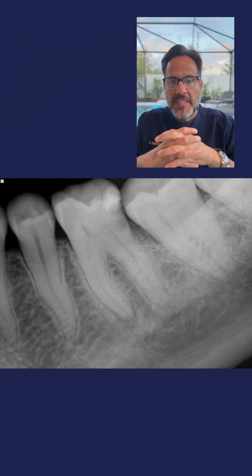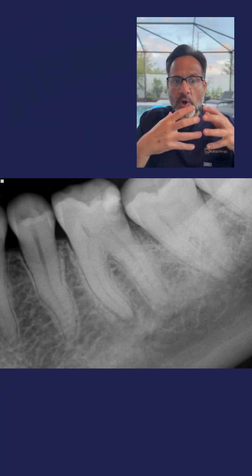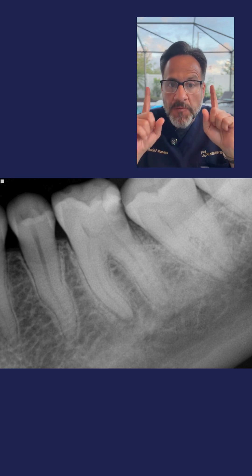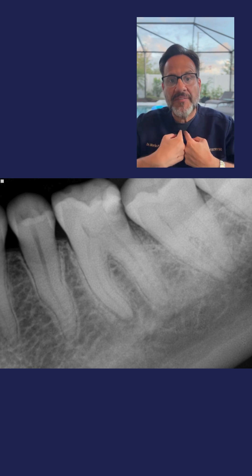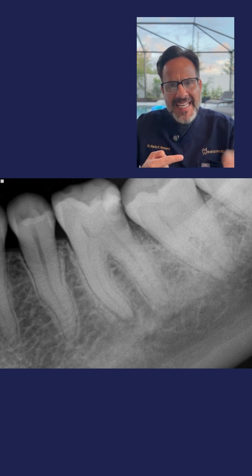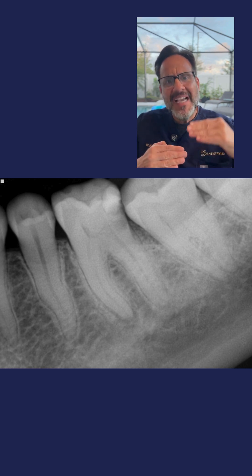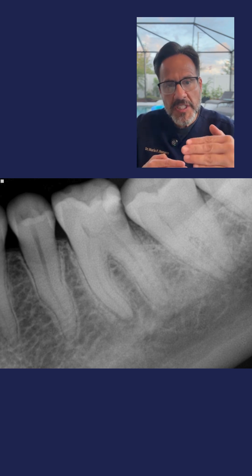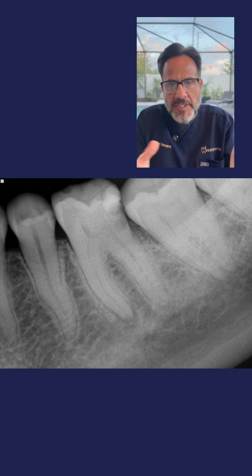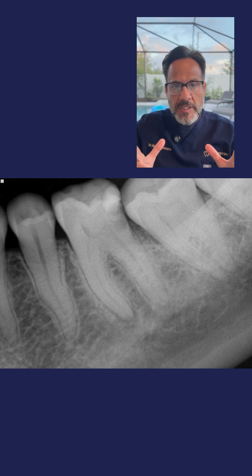The myth surrounding the deep margin — can you elevate it? Looking at photo number one: a very deep cavity on this first molar, already into the pulp. The patient needs to go to the endodontist. But before we refer him, we have to decide as restorative clinicians: can I restore this tooth? Can I elevate that margin supragingivally so that I can create good access to this margin? That's what this reel is all about.